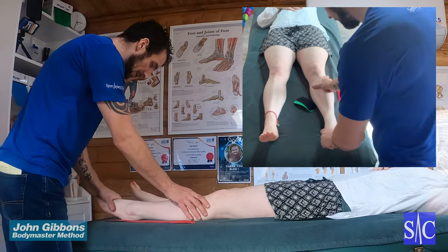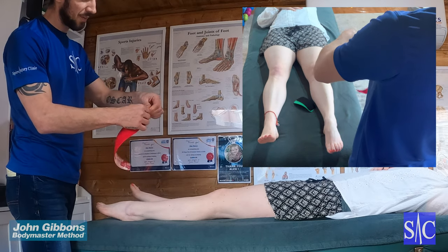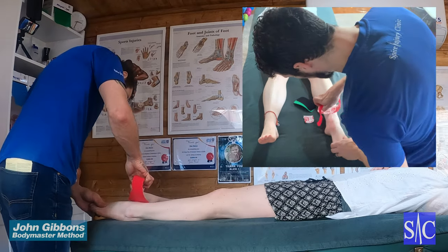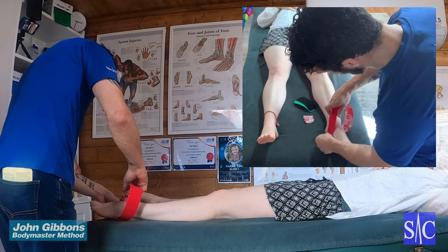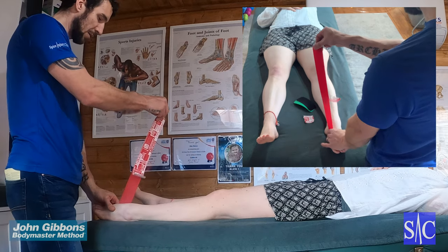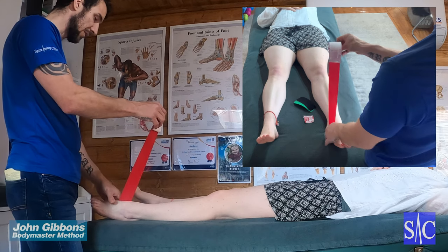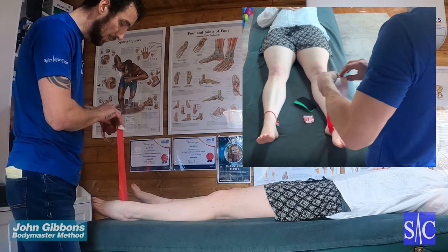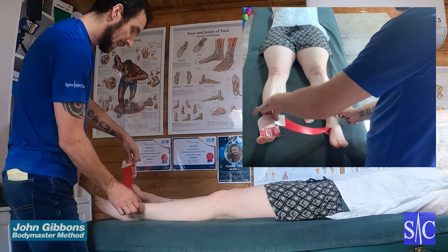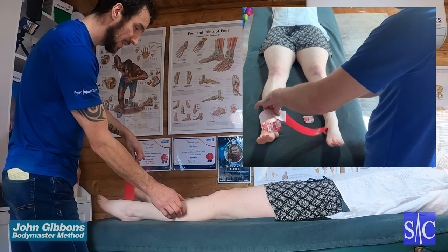To start, you want the toes nicely pointed away — that's going to put stretch through the tissue. Take the first piece, rip off the first inch to expose the tape, and place it down just by the medial arch of the foot. Then secure it, pull the backing off, and leave about an inch to hold on to. You're going to go through the center of the ankle — there are two ankle bones there, go right through the center.